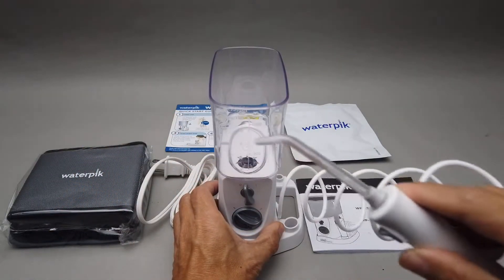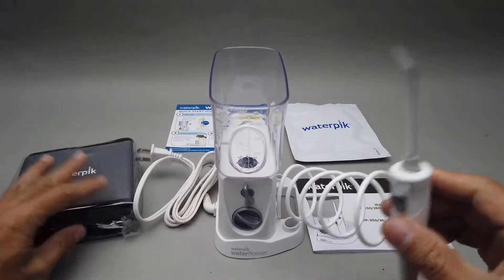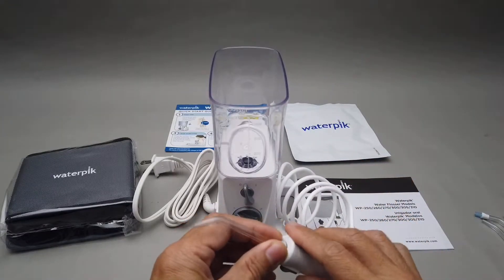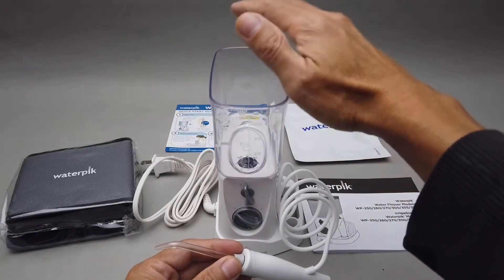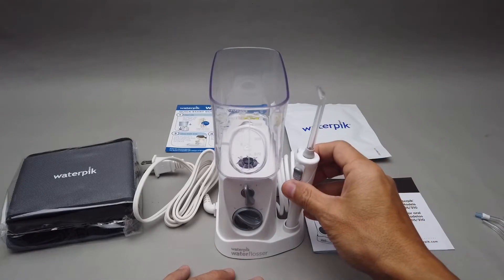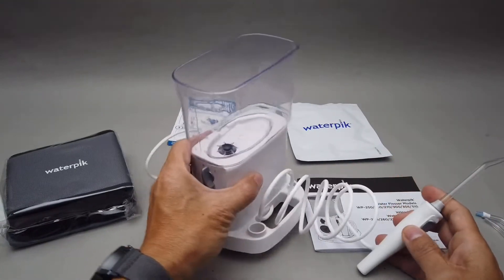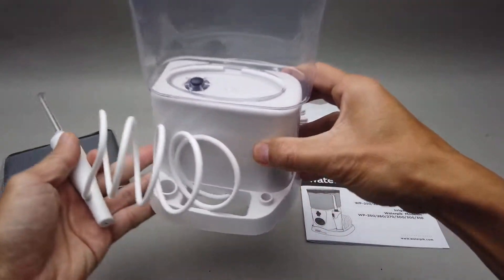Now put the water in, stretch it out, and you can start spraying — of course, turn on the power. That's a very simple setup; it only took me about five minutes to read through. One thing to note: the Nano doesn't have a lid, so you don't want to leave water in it and walk away in a dusty area or when vacuuming — dust can get into the water.